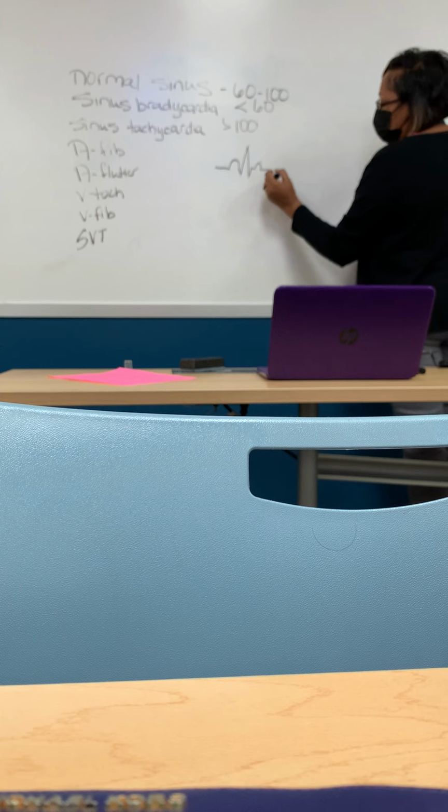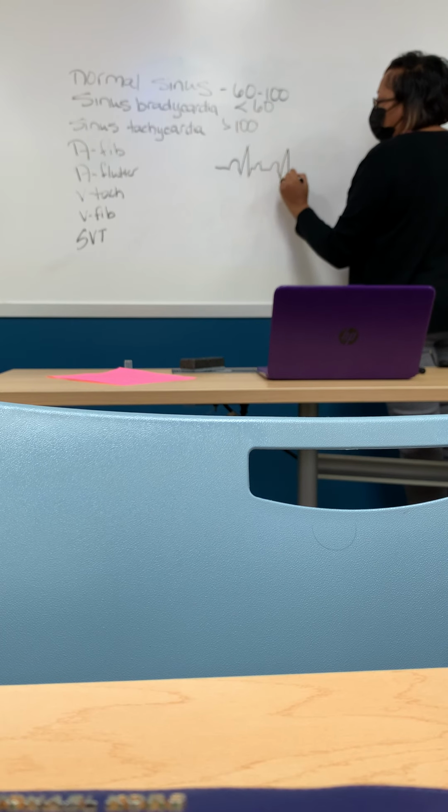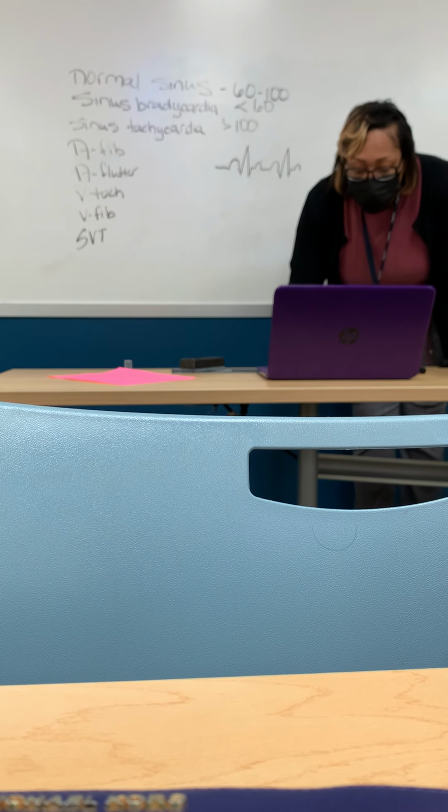So if this continued, and I have another P and a T, that's 2. Okay? And it's gonna keep continuing. Look at the slide.